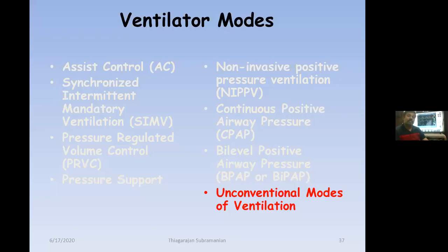High frequency oscillatory ventilation is another method which can be tried. In Italy, during the time of the pandemic, they used high frequency oscillatory ventilation, and it worked very well and was effective in these specific cases.